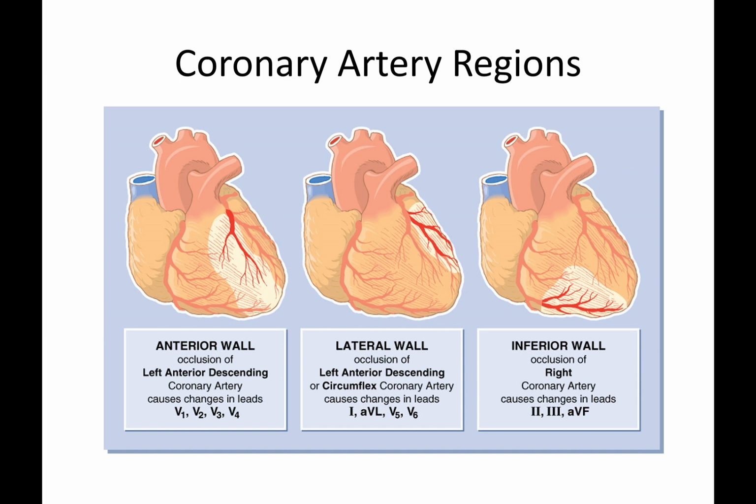So coronary arteries. Take the previous slide plus all the other knowledge that we've gone over, and now we can apply it to real life, which is figuring out which coronary artery has been affected by the MI based on what changes we've seen in those leads.